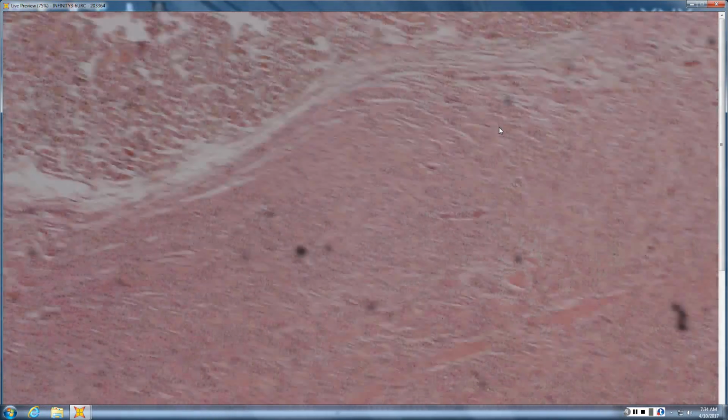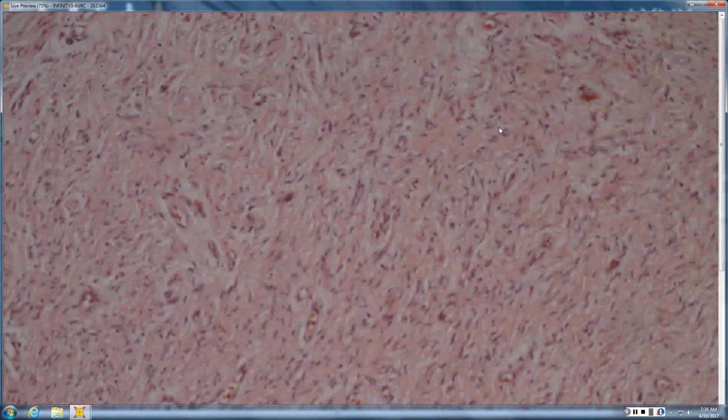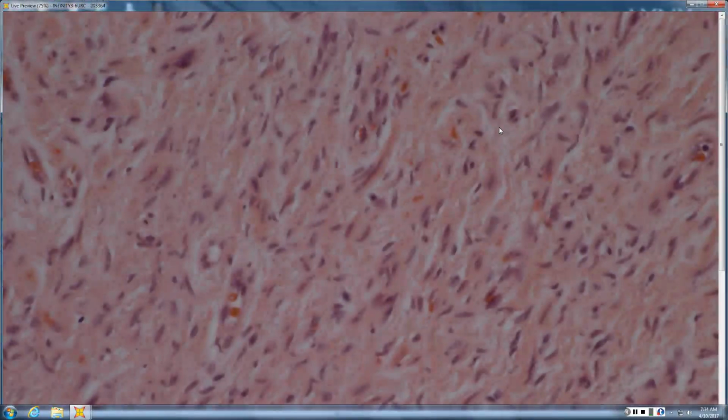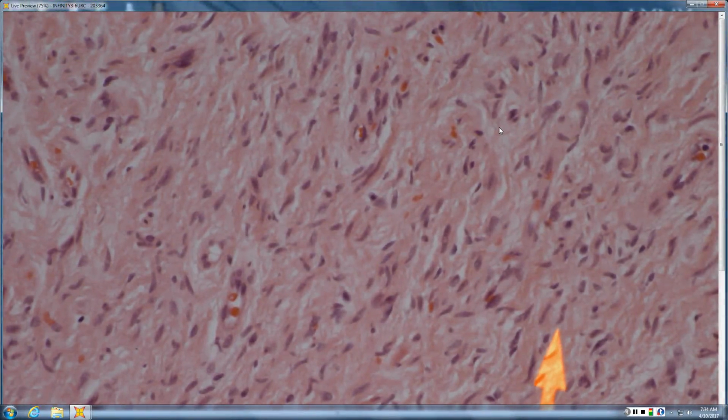Okay. James, what do you see? So it's like a big proliferation of fibroblast-looking cells. I mean, it could be just NF as well. So it's certainly loose and kind of myxoid. What do you think on higher power for NF? No, I guess if you haven't stopped asking me. Or yes. Well, that's misleading. Sorry, it wasn't meant as a trick. Is it still NF? Well, you tell me. That's what I think it is.